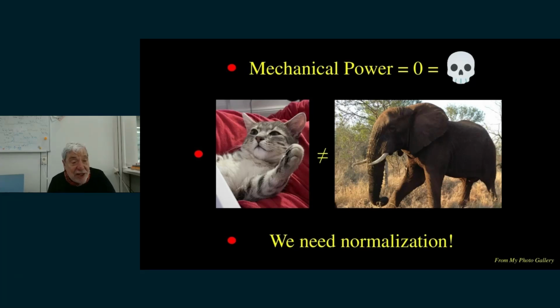We need some energy, because if we have zero energy, we die. But we need a normalization. And your experience is a good way to normalize: what do I expect in terms of normal total ventilation. I think, to have a reference, if my ventilation is 2, 3, 4 times that, it may be dangerous.